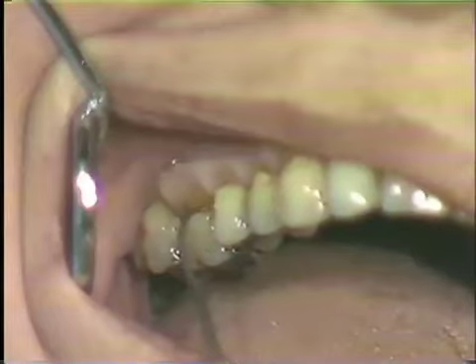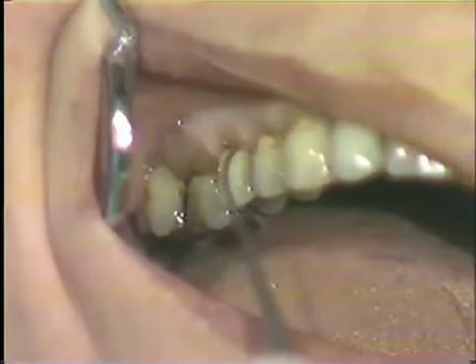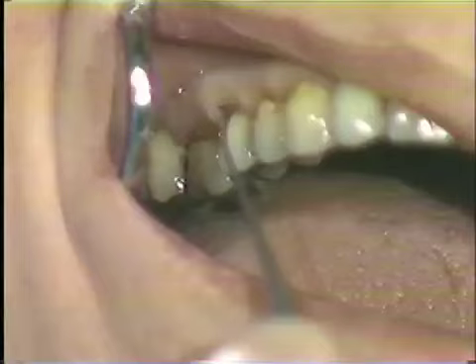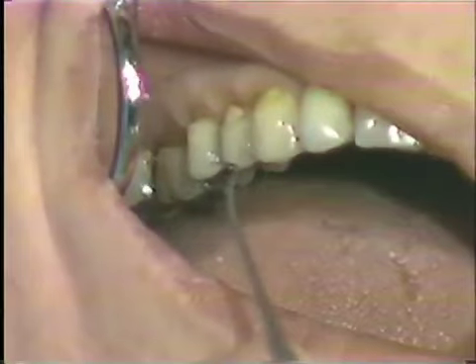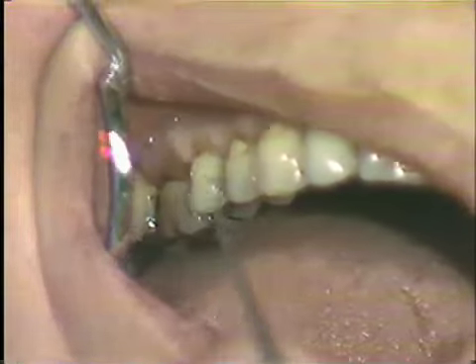On tooth number 3, it's obvious that there is a definite notch at the cervical portion. This is also evident on tooth number 4. You can see that the probe enters into this notched area very readily. These two teeth have been restored, probably for the reason that we've just demonstrated, not necessarily decay, but destruction of the tooth by either the abrasion or erosive process that has caused the notching.